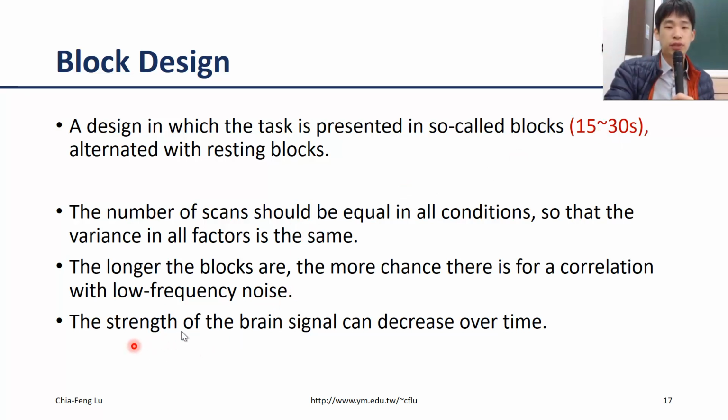Okay. The final one is, please remember that not only may low frequency noise mix into your signal if you use longer blocks, but also the strength of the brain signal can decrease over time.